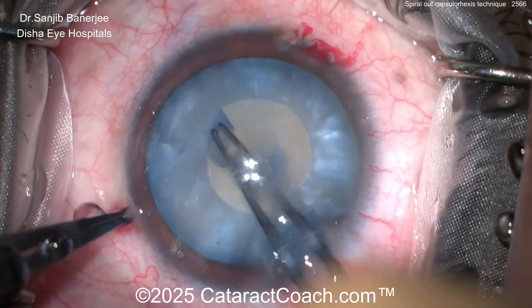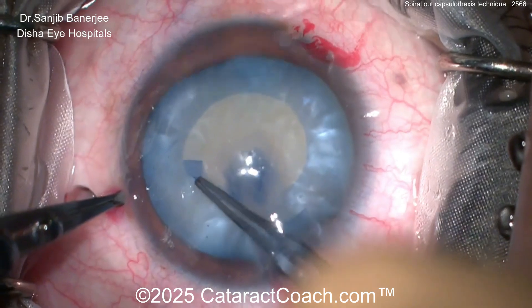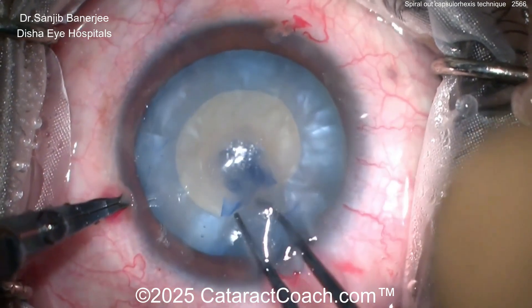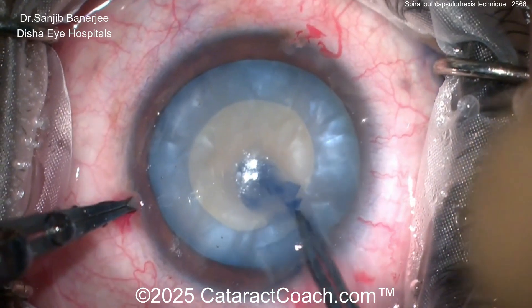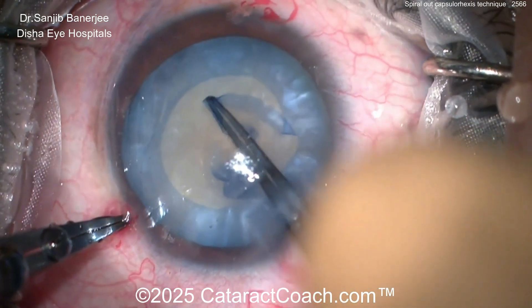Spiral, spiral, spiral — beautiful, very nicely done. White cataracts are my favorite ones in all of ophthalmology. My favorite cataract surgery has got to be a white cataract, because it's like the closest thing we have in medicine to a miracle. Think about it — a patient walks into your clinic totally blind, and through the magic of a beautiful cataract surgery, that patient can leave your clinic seeing. That's just amazing.